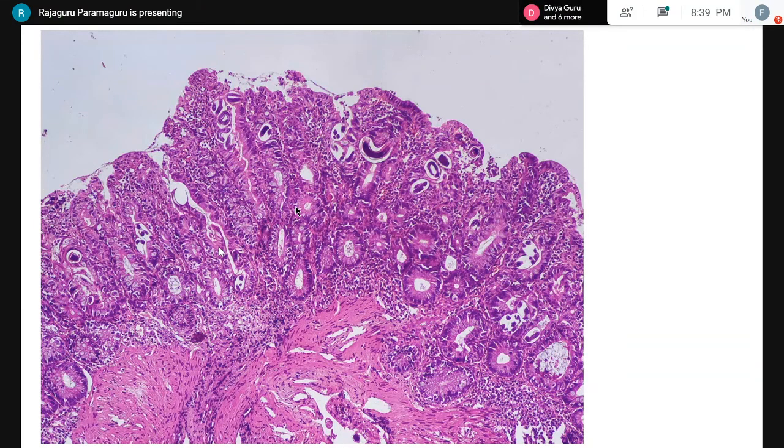So this is another infection which usually affects the immunosuppressed. These are not to be confused with the apoptotic bodies. These are not within the epithelium. These are seen lining the surface epithelium. There are some other infections, the microsporidium and the isospora, which I have not covered.